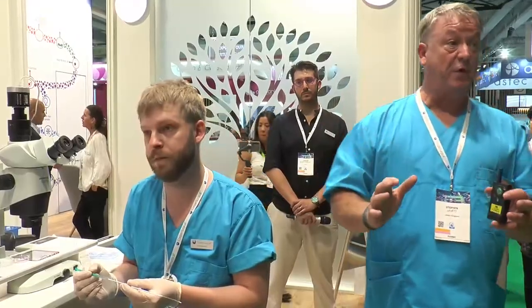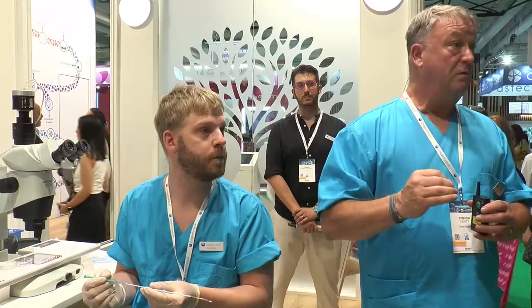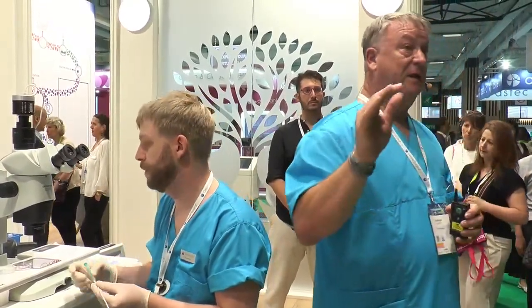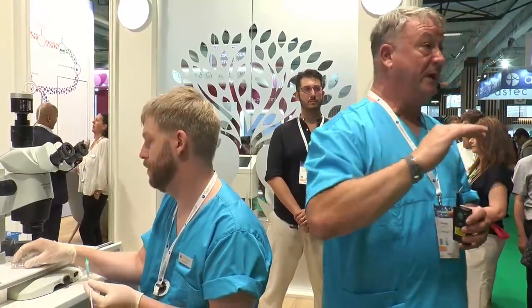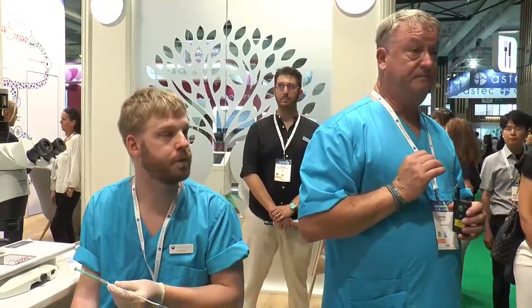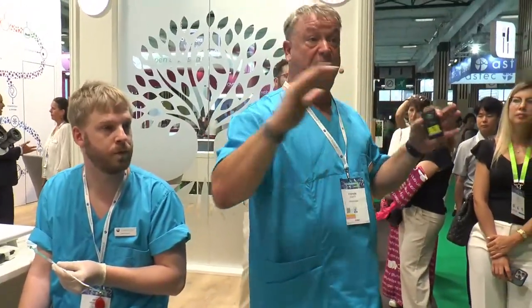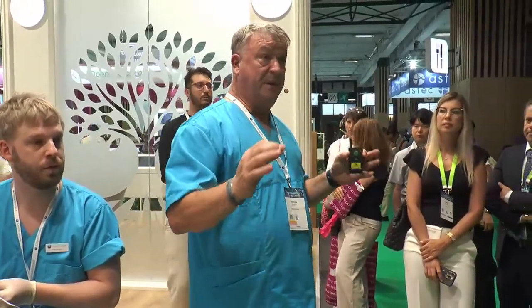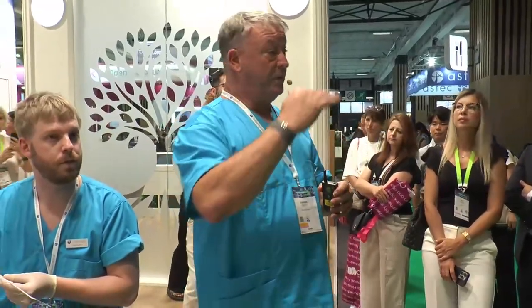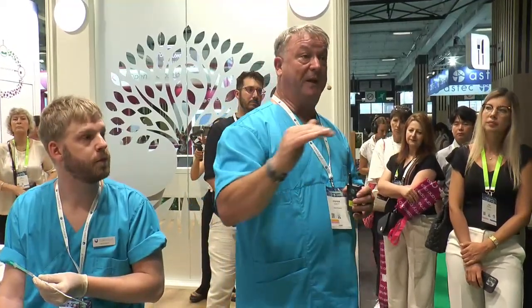We also need to train the people who are doing embryo transfer. So we know there is operator variability. If you have a clinic with 20 clinicians doing embryo transfer, they don't all have the same success rates. We have to measure on standard patients, so we don't measure the whole population. When we're doing KPIs, we pick a single population, good prognosis patients, and we measure the data based on those patients. That then gives us a level playing field.